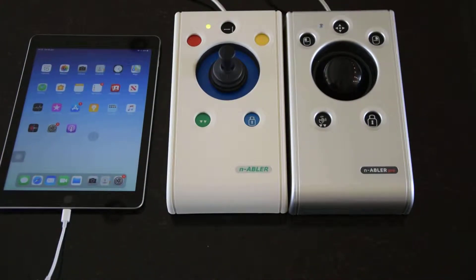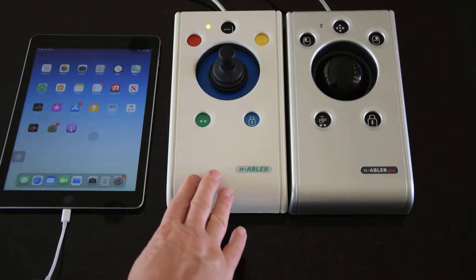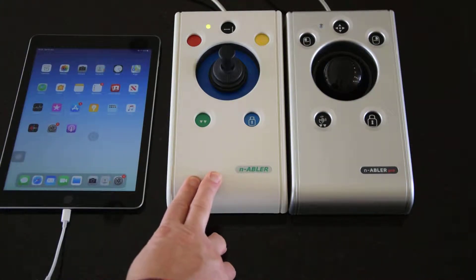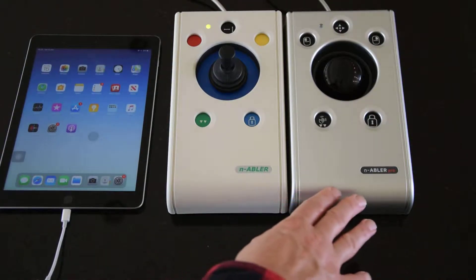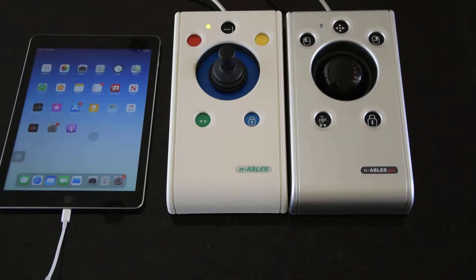There are four individual products in the Enabler range, though only two are shown here. The standard Enabler is the beige coloured unit with coloured buttons, available as a trackball and a joystick — and the same for the Enabler Pro, again a trackball and a joystick. The main difference is the colour scheme and the high visibility buttons on the Enabler Pro, but there is also another feature which will be introduced shortly.